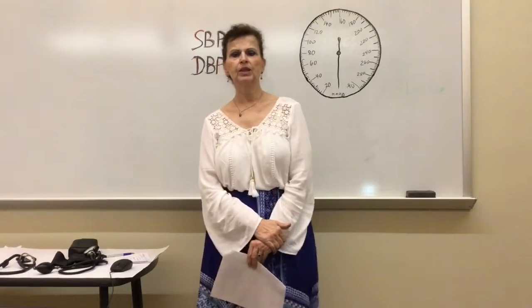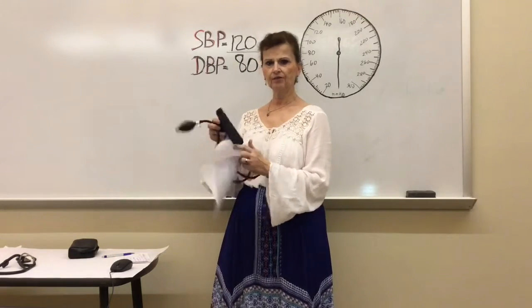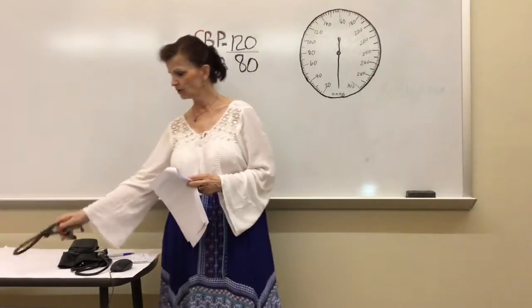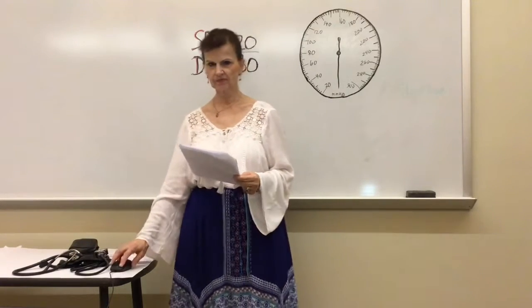The equipment you will need is a sphygmomanometer, which is right here, and a cuff, plus a stethoscope, an alcohol wipe, and a paper and pen for documentation.